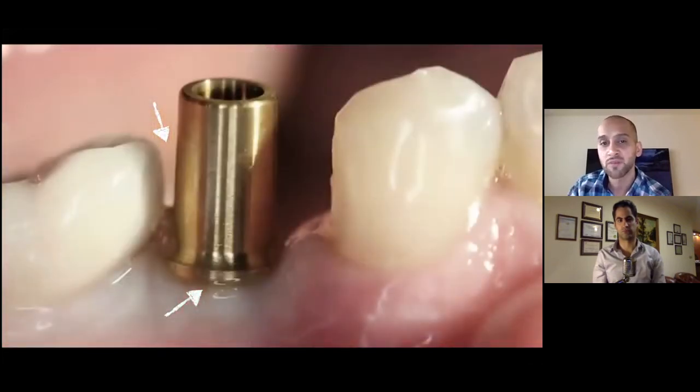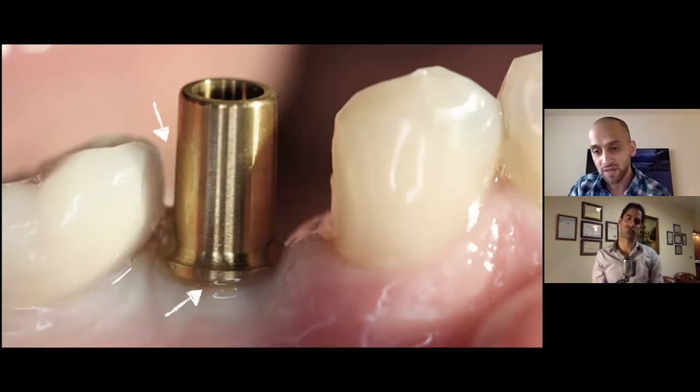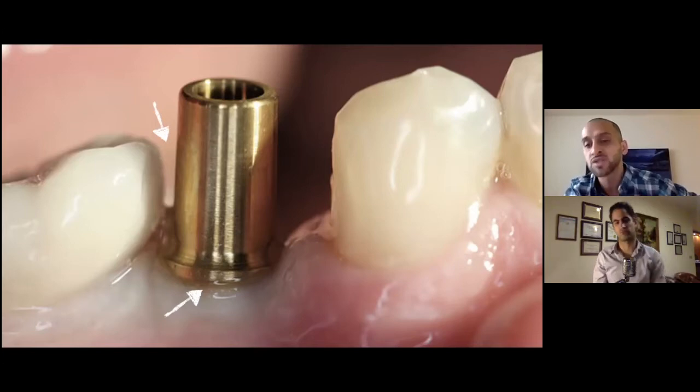I'm sure you have seen these abutments yourself, Omid. In America, we call them stock abutments. There is no attention to the finish line. The finish line pays no attention to the gingival sulcus, for example. And you can see distal to this implant right now, you have to trim or mill or cut that part of the abutment to make room for your prosthesis. So this is not a customized abutment.